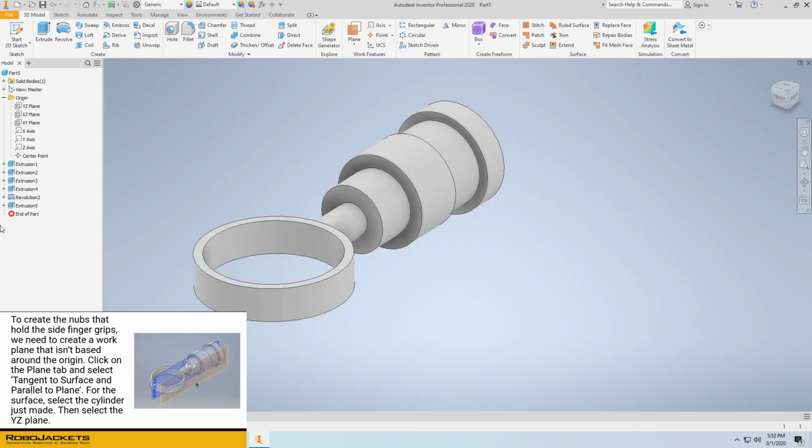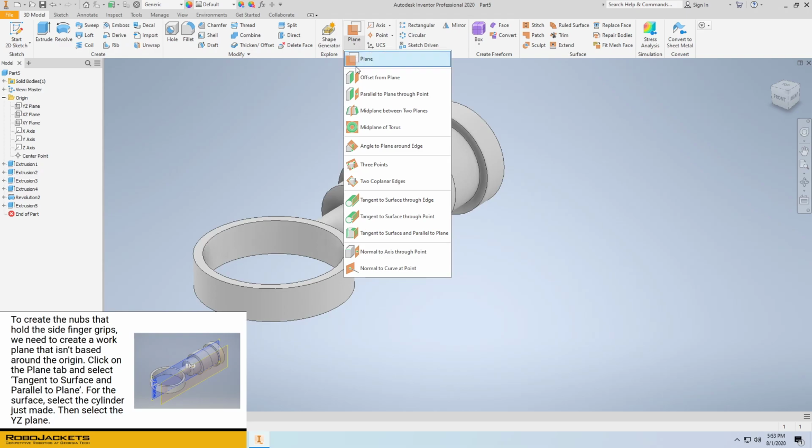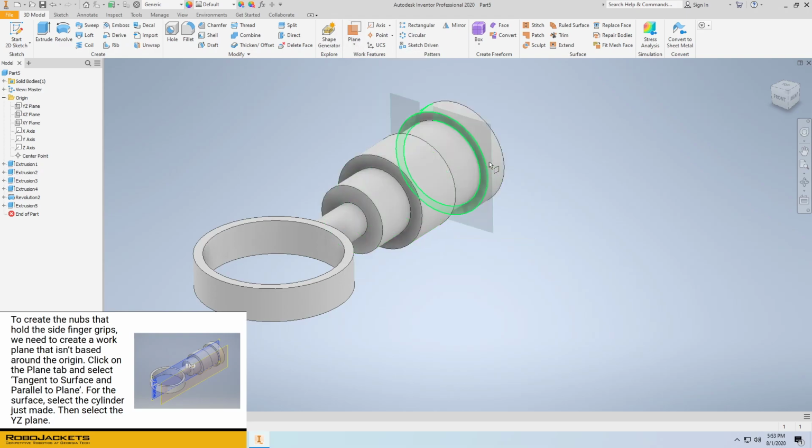Now, we'll get started on the nubs that will support the other two finger holds. To do that, let's go to Work Plane with the Plane tool, specifically the Tangent to Surface and Parallel to Plane tool. Selecting this new cylinder, as well as the YZ plane, we go to Work Plane that is parallel to that YZ plane, and it just barely kisses the tangent of the cylinder. We'll create a new 2D sketch using this work plane.